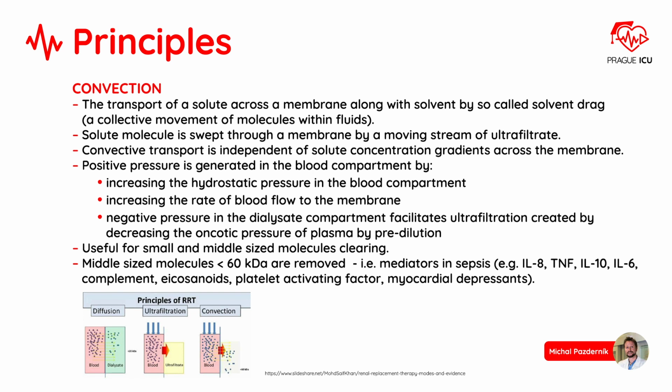Positive pressure is generated in the blood compartment by increasing the hydrostatic pressure in the blood compartment, increasing the rate of blood flow to the membrane, and negative pressure in the dialysate compartment that facilitates ultrafiltration, created by decreasing the oncotic pressure of plasma by pre-dilution. It's useful for small and middle-sized molecules clearing. Also, middle-sized molecules, such as mediators in sepsis, are removed.